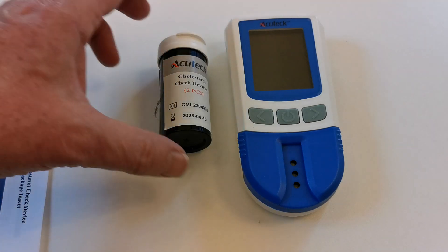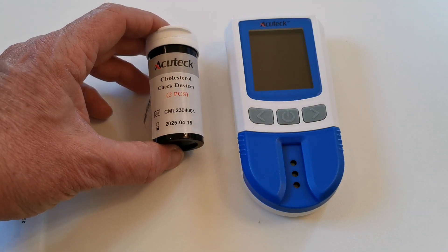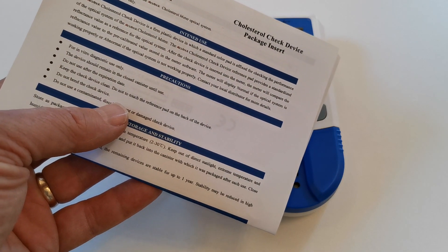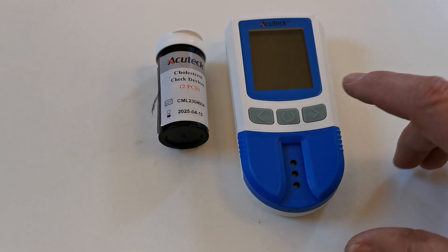The check devices pack of two will have been supplied with the original purchase of the meter. You will also have received a cholesterol check device package insert instruction, which is separate from the main instruction booklet supplied with the meter.